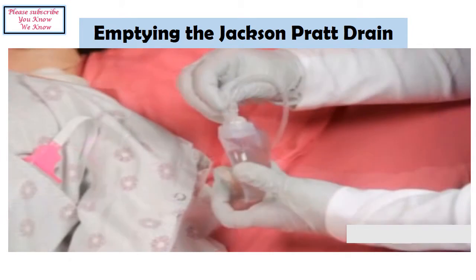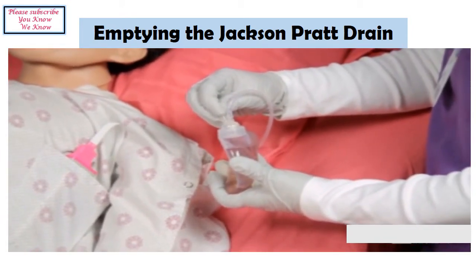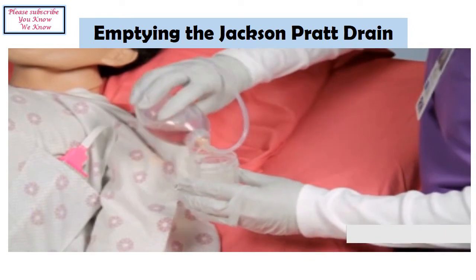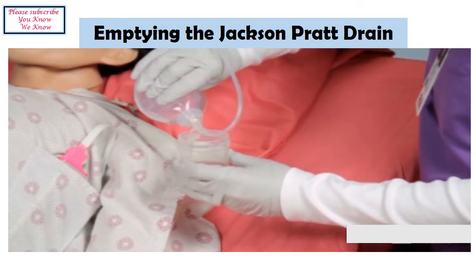Then pull the stopper out of the bulb to empty the bulb. We can collect the drainage in a clean cup. The exact amount of the drainage should be documented in the intake and output chart. Then the drainage can be discarded.